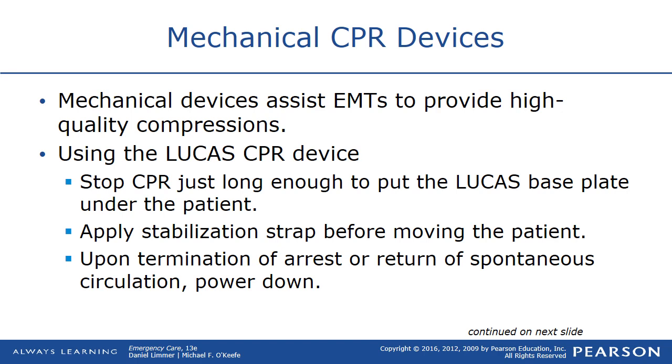There's another thing called the Lucas CPR device that does automatic CPR. You stop CPR just long enough to put the Lucas base plate under the patient, and then you stabilize the strap before moving the patient. And upon termination of arrest or return of spontaneous circulation, you power down the device.